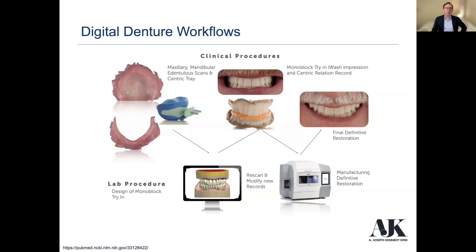Now, this is some years old and we've really dialed it in. They're showing that they're going to manufacture it with a subtractive method using pre-polymerized PMMA. But even so, it's just nice to go over some of the techniques here.